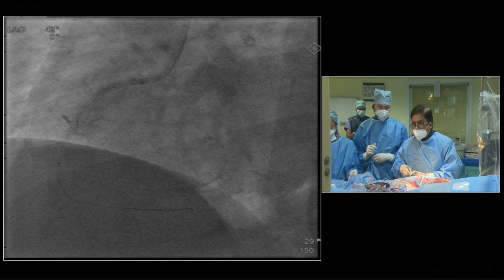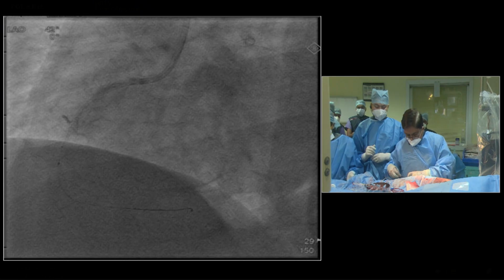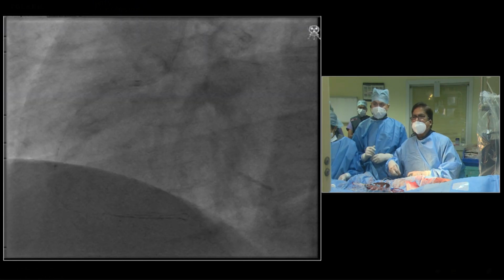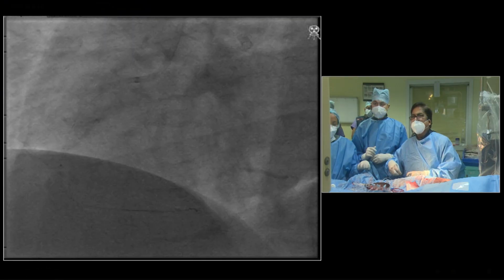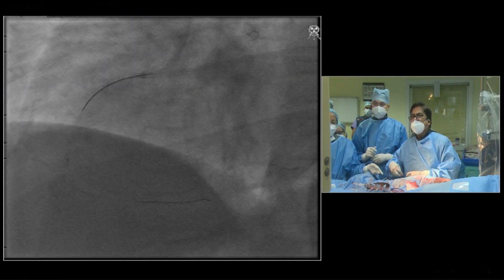The distal marker is actually on the wire that you've gone through, which is usually either the side branch or the parent branch. The proximal marker is where the other wire will exit. I have taken the Sion wire because I think it is patent.